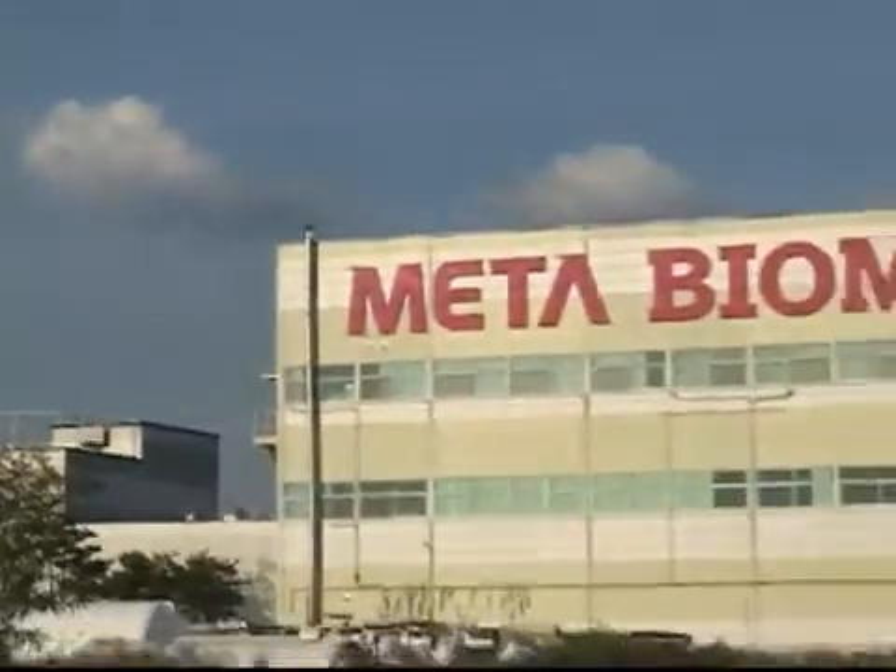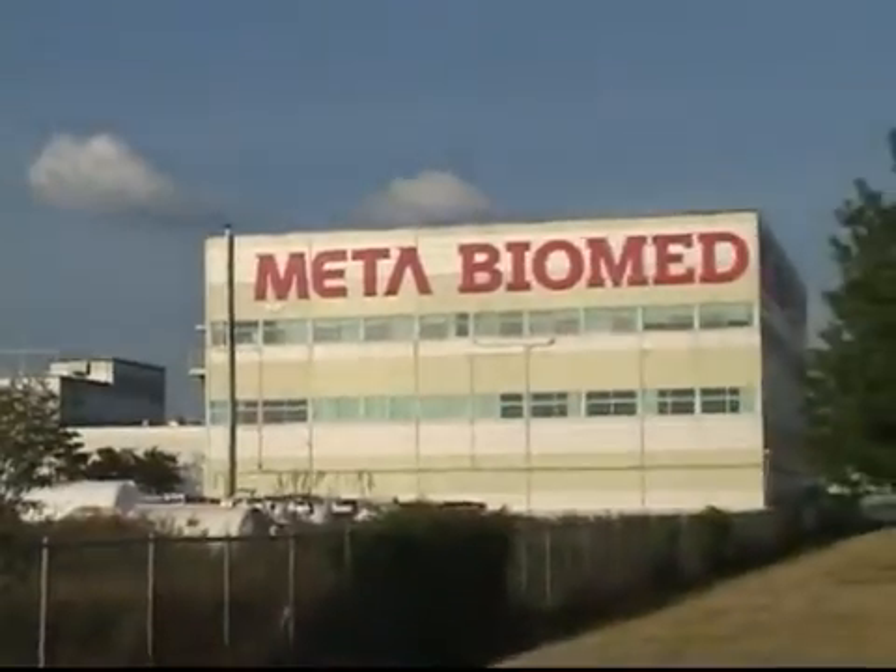A company specialized in dental material and equipment, which has contributed to development of dental industry — MetaBioMed.